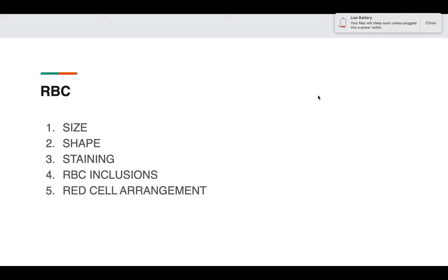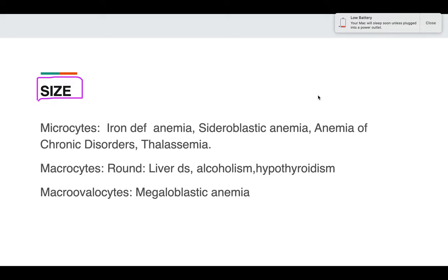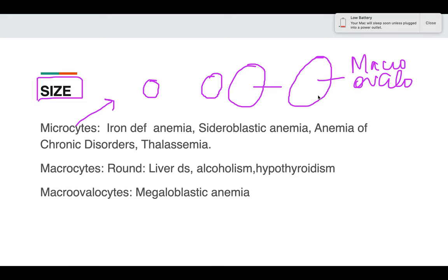When discussing abnormalities of the RBC, we discuss abnormalities in the form of size, shape, staining characteristics, RBC inclusions, and red cell arrangement. Regarding size: if the size is less it is known as microcytes, and if it is more it is known as macrocytes. In macrocytes you also have round macrocytes and sometimes macro-ovalocytes, which are oval in shape.